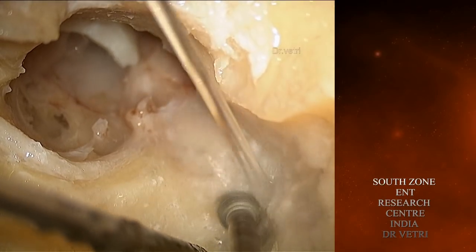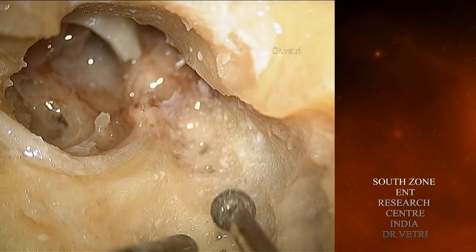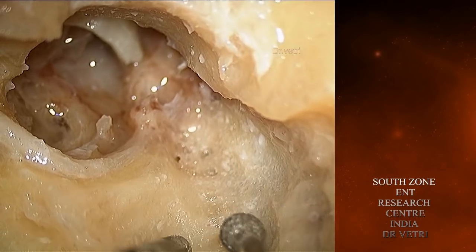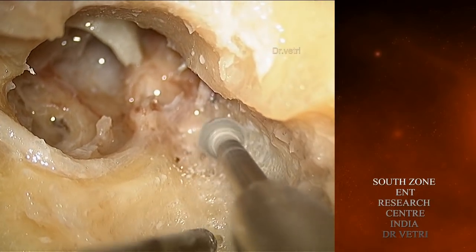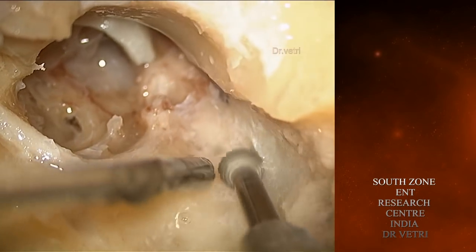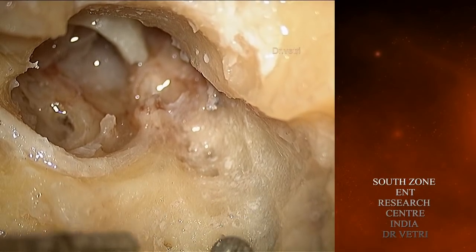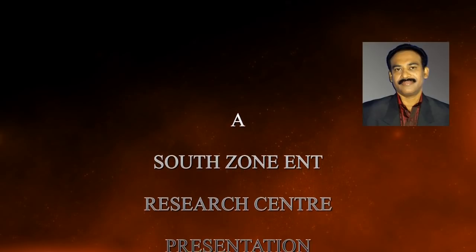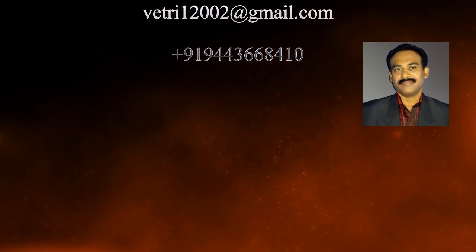All the boundaries should be completely cleared. We are preparing ourselves for the next step, which is to completely delineate the semicircular canals. We will proceed to the next exercise now.